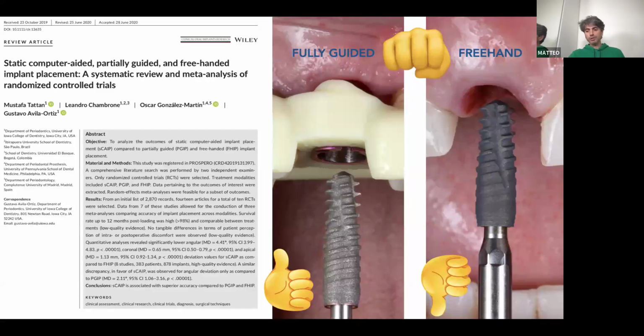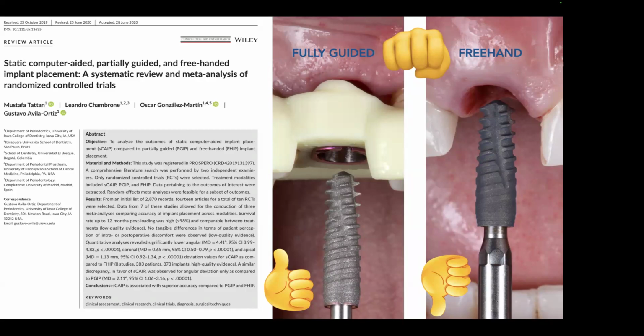So, from the literature, we know that the fully guided protocol is more precise than the freehand placement of the dental implant.